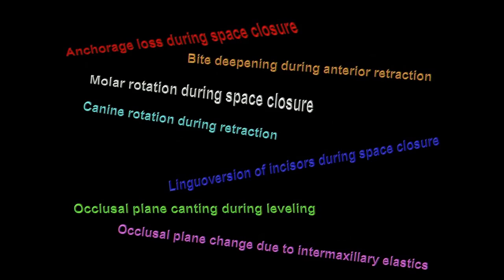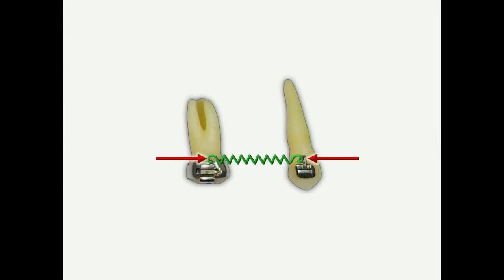These are side effects that we frequently observe in daily practice. Most of them are tooth movement in undesirable direction, both in active and reactive part of the arch. Suppose we would like to retract a canine, not only distal force, but there is always reciprocal mesial force acting on the posterior teeth. No matter how cleverly we design the appliance, we cannot overcome the law of nature.